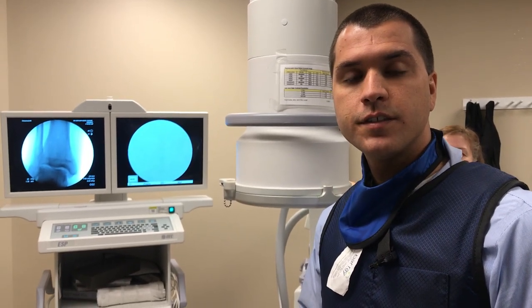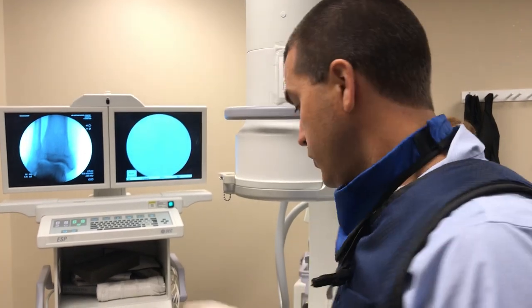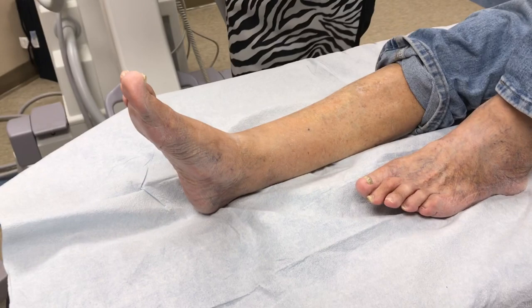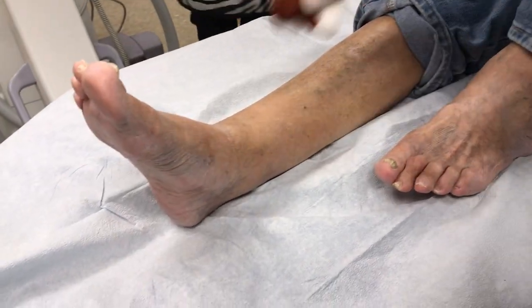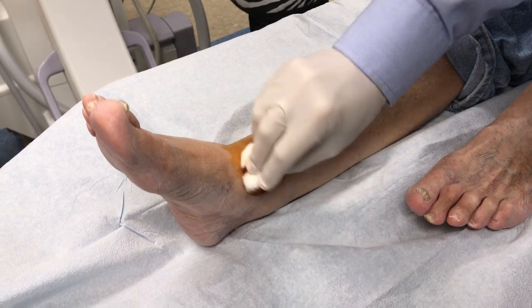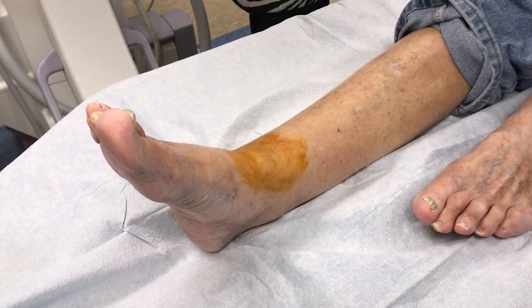This is Dagan Cloutier, Physician Assistant, and we're going to be going over an intra-articular injection of the ankle. We're going to prep the ankle with betadine and alcohol, and we're going to go just medial to the anterior tibialis tendon and above the talus.